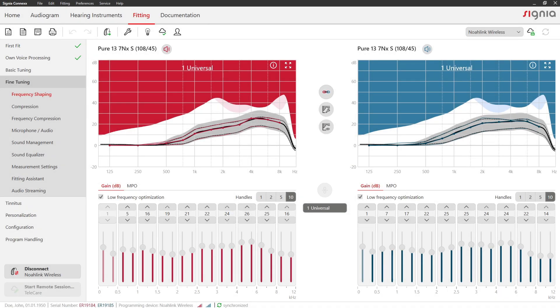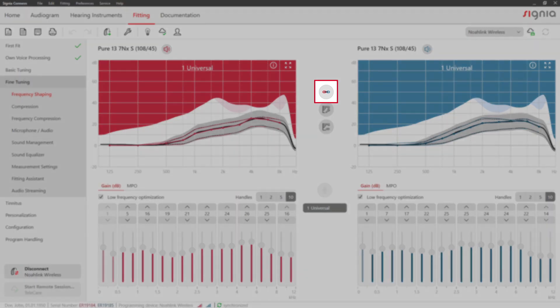By default, all changes that you make here will be applied to both ears. You can change that with this button.